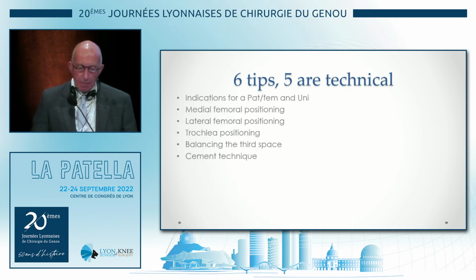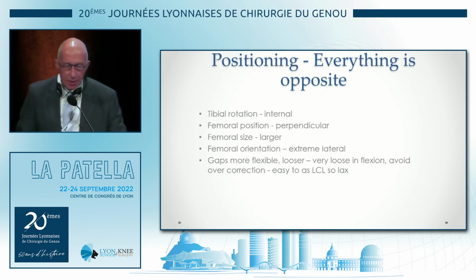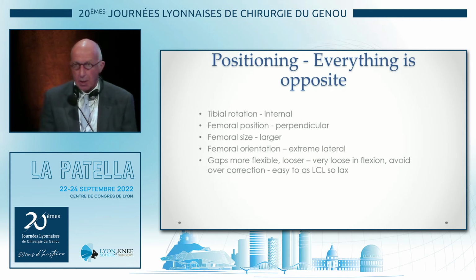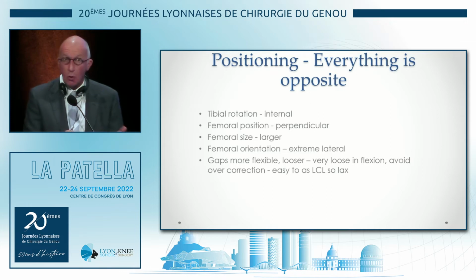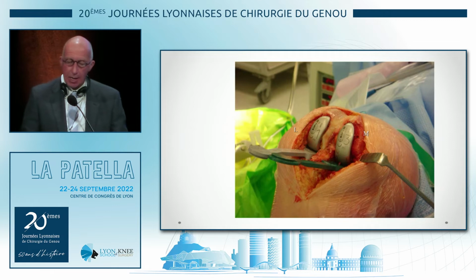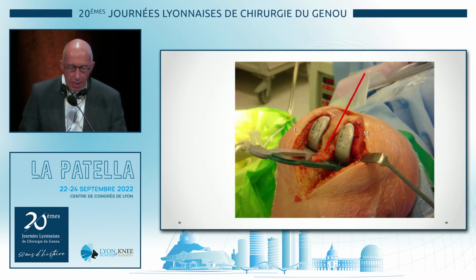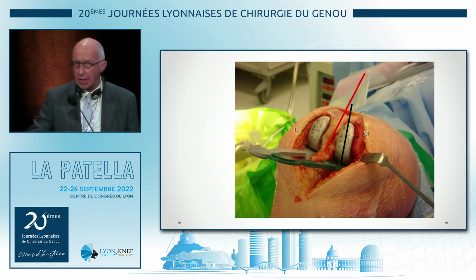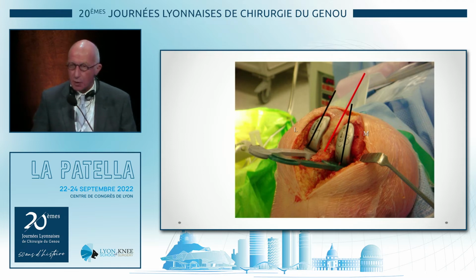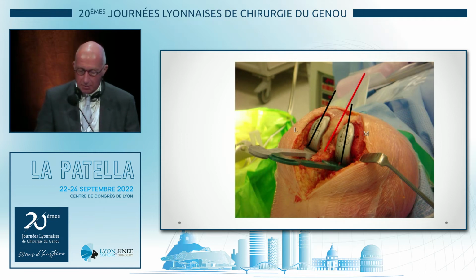So medial and lateral femoral positions we can take together. The lateral is different to the medial, so we're talking bicompartmental. That can be lateral and pat-fem or medial and pat-fem. You can see this clearly, how different it is for the implants. That's the white side line. And you can see on the medial side, I'd like to tilt it in a little bit to follow the kinematics. But on the lateral side, it will be perfectly perpendicular.